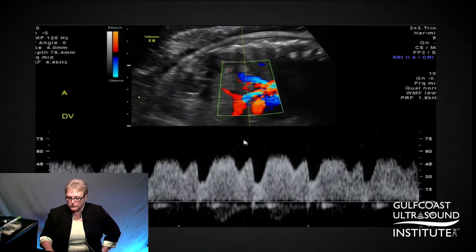You can do it either transversely. This is what the normal ductus looks like. We want to see good flow.